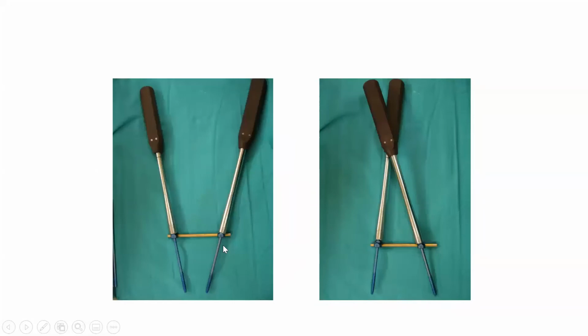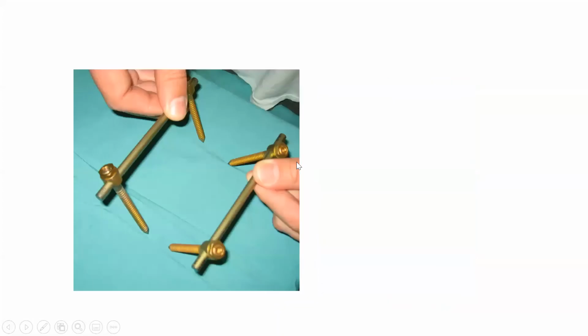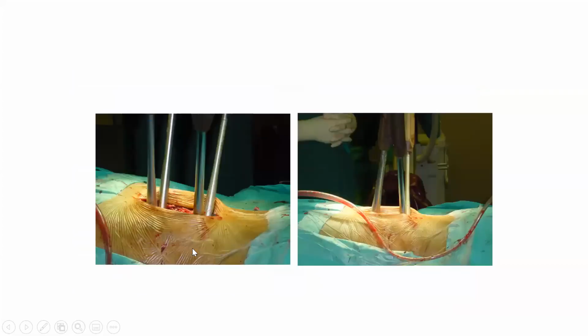So with this long tool we can move them. We put them in like that because the fracture is in kyphosis, and you can then cross them over into lordosis and fix the segment there. So your screws remain in position on the rod. It's a great trauma system, very old, but it works very well. And obviously, converging on both sides, you're getting really good pull-out strength.